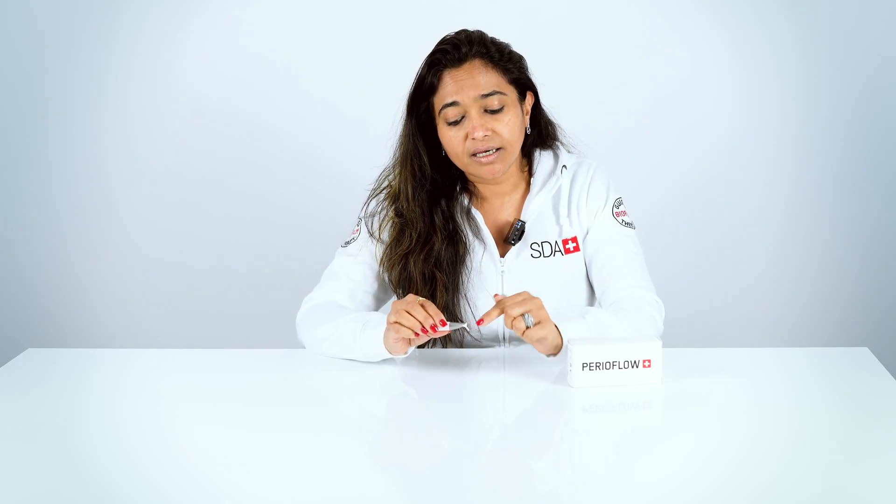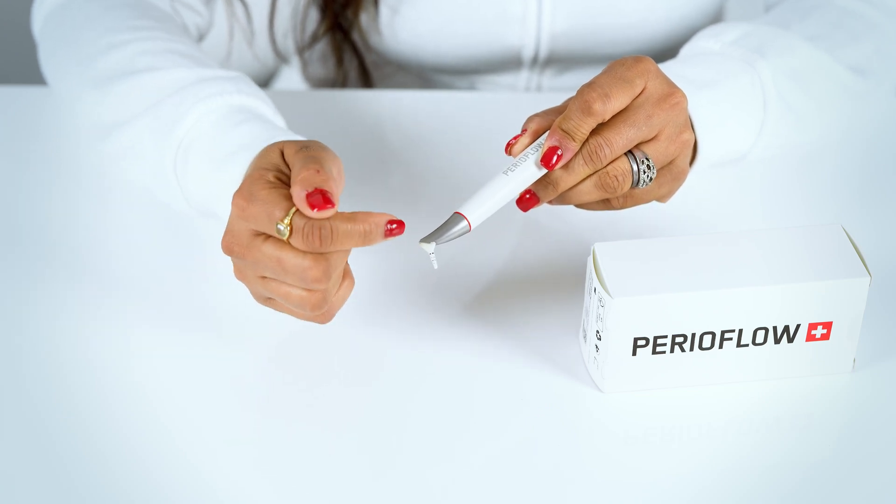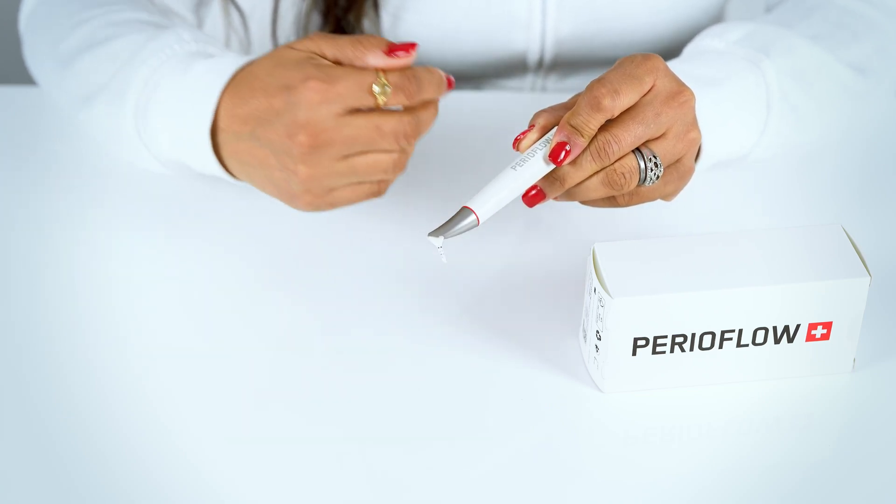The nozzle has markings of 3, 5, 7 and 9mm, hence even helping us to eliminate the process of probing before using it for dental treatments. It's a flexible nozzle with an additional groove for increased safety when we use it subgingivally.